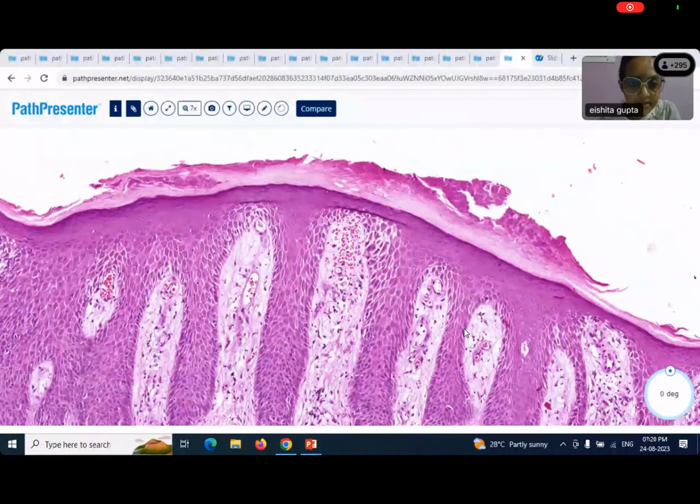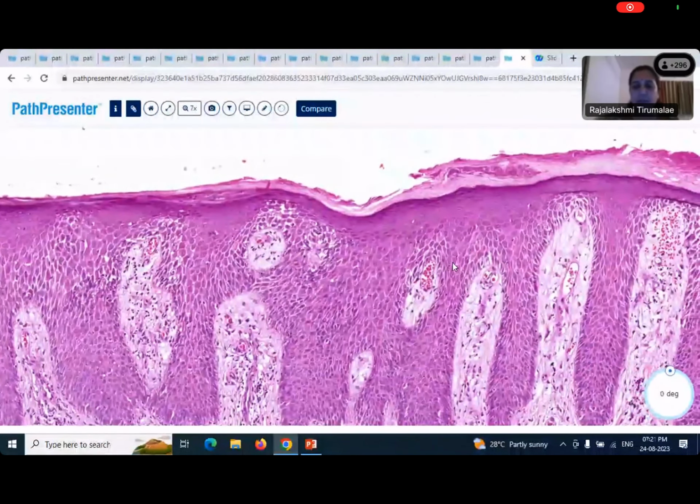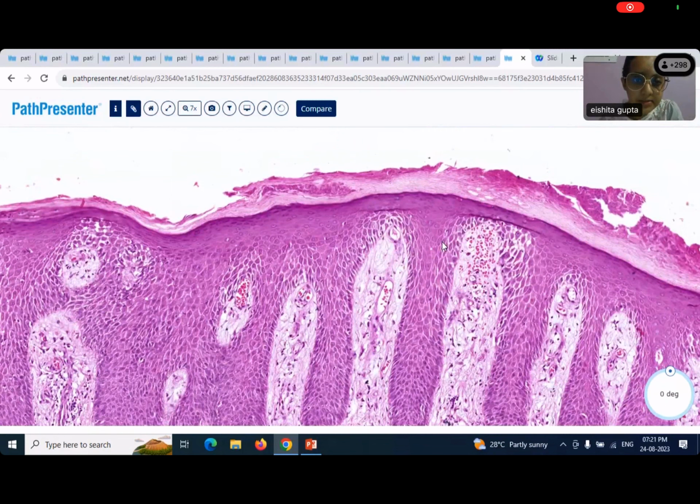It's a hyperkeratosis. What is the pattern of the stratum corneum? You have to start with that. Start from the stratum corneum and then go downwards. What is the pattern of keratinization that you see? It's a hyperkeratosis. So normally it would be basket weave orthokeratosis, but here you see the keratin is very compact and pink, right? Yes. So this is orthohyperkeratosis.